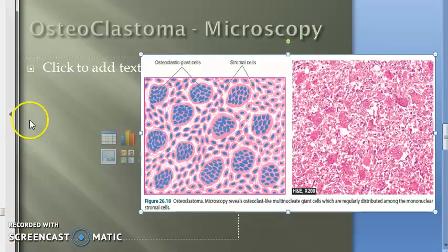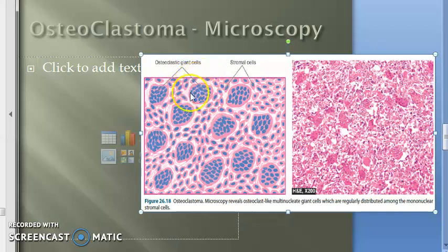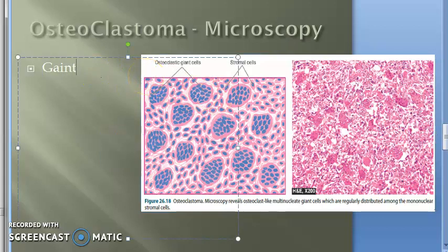The hallmark features of giant cell tumor are the presence of large numbers of multi-nucleate osteoclast-like giant cells regularly scattered throughout the stromal mononuclear cells. Here you can see the osteoclast giant cells — osteoclasts destroy bone. So there are multi-nucleate osteoclast-like giant cells scattered throughout the stromal mononuclear cells.